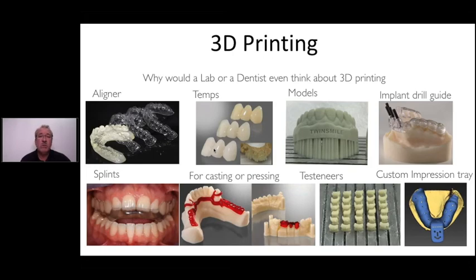We think the next step will be printing temporary dentures in the future. We are thinking even to start printing dentures as a 6 to 8 month solution. Like when you throw your monthly lenses away, why not have a yearly denture? Every year you get a new denture. And relining is no problem because you scan the impression and just reline it digitally.